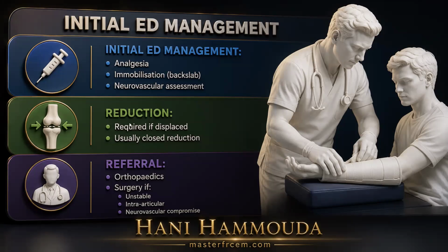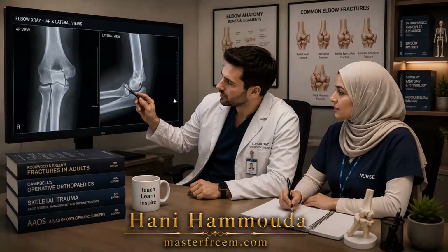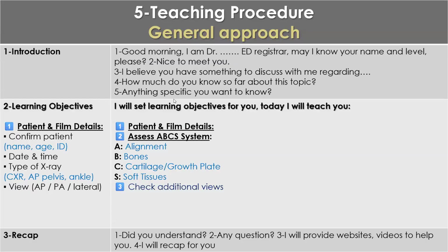Thank you. Okay, last station for today, elbow fracture X-ray. Who is happy to do this station? I will give an idea. I can do it if you give an idea. Can I do it, sir? Anyone who did not practice today? Okay.